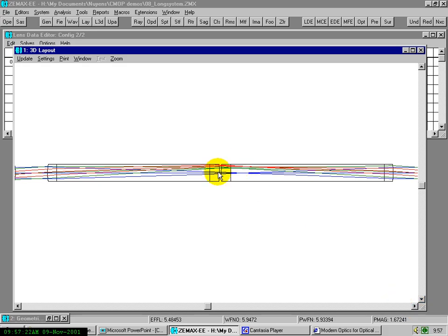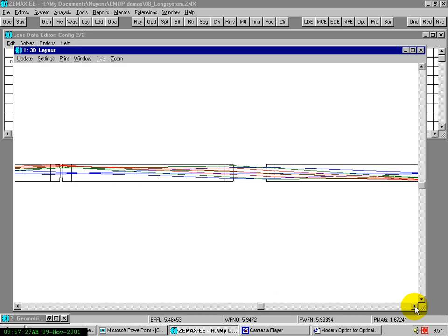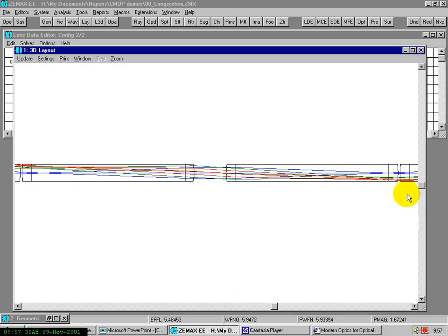In the second relay stage, the same happens. And here again. And now we see the significance of the field lenses. Because now the field lenses act as imaging lenses for the aperture stops. Here we have an image of the aperture stop. And this image of the aperture stop is re-imaged by another image of the aperture stop. And that is done by the field lenses.